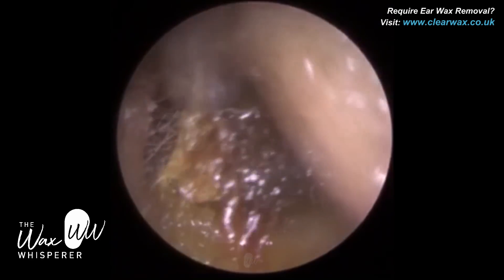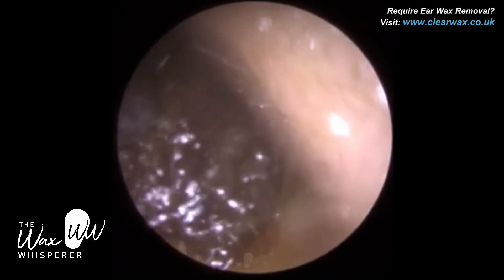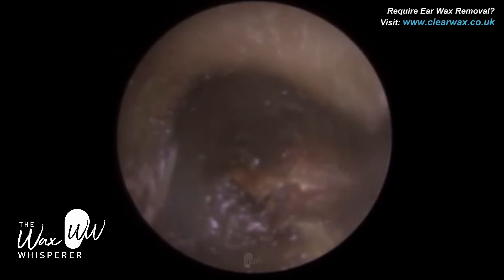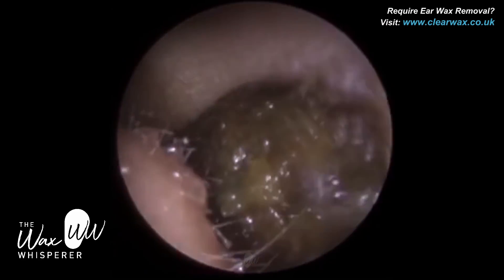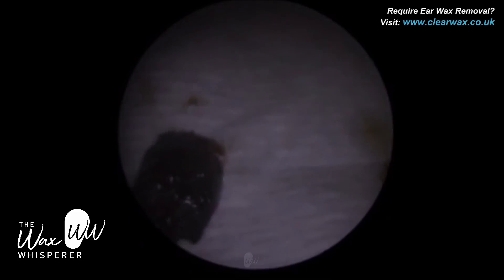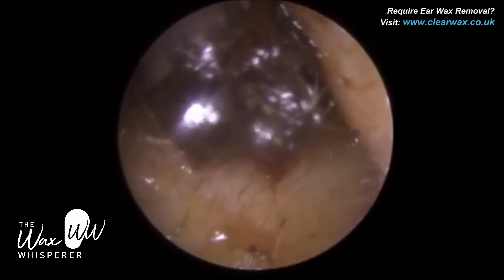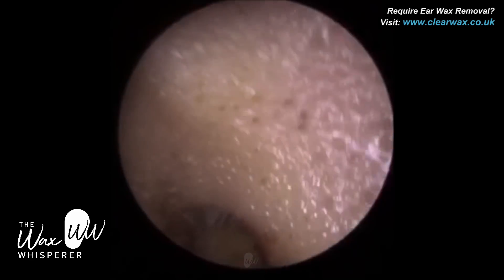This wax is literally hanging out of the ear at the moment. I often joke with patients that it's almost like delivering a baby — I can see the head of the wax. You can see just how dark this plug of wax is; it's extremely dark, it's been there a while and has oxidized — almost black. The whole plug didn't come out in one big mass because it got trapped at the entrance and divided into two.